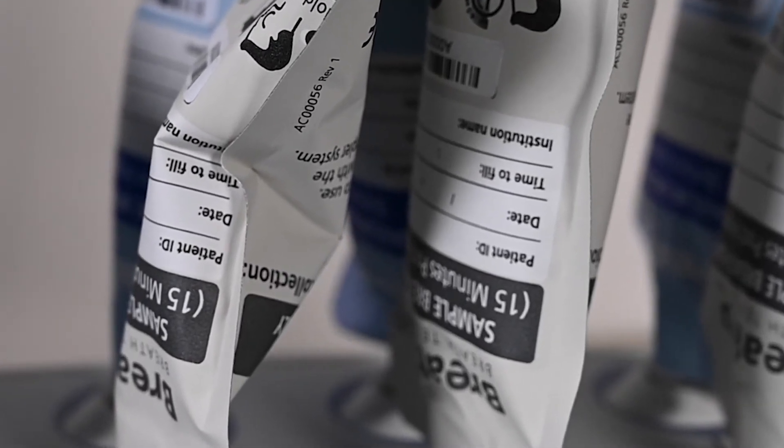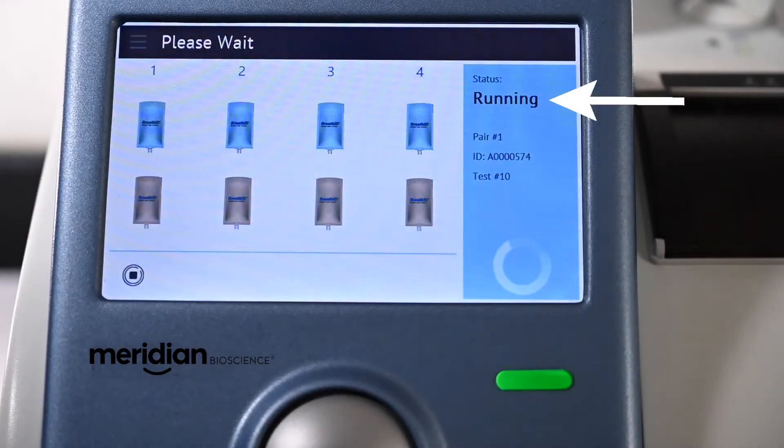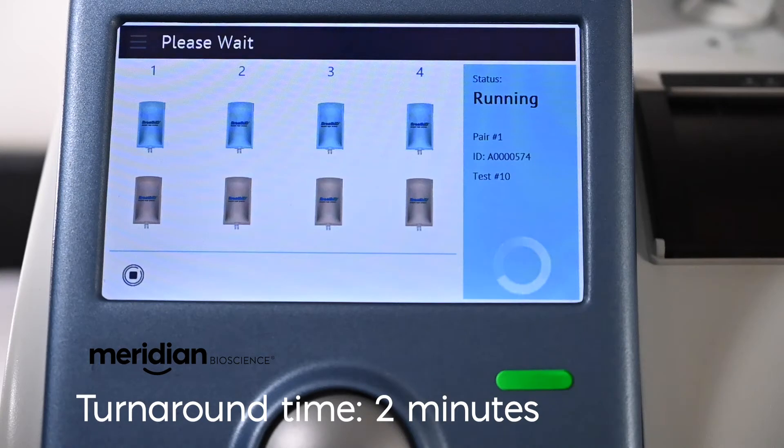Analysis begins immediately after pressing start and status switches to running. The information is located below the current pair being analyzed. It takes two minutes to analyze each specimen pair.